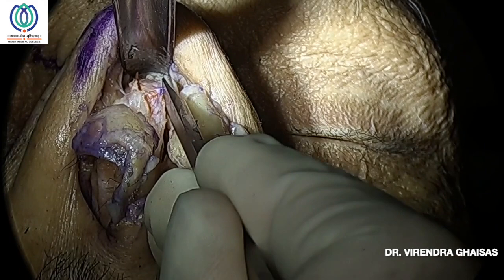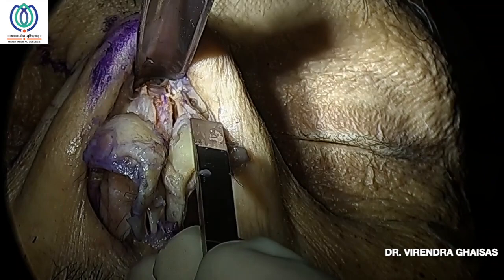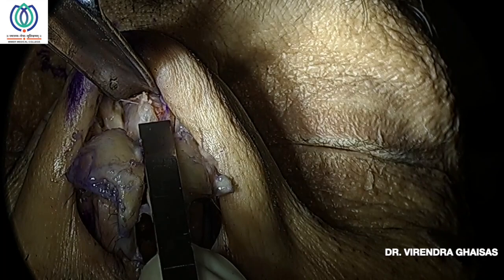Take 2 small stab incisions at the midpoint of the medial canthus and lobule, a little 2 or 3 millimeters above the midline where the nasal length is more, or if you are operating in the mid portion, then you should take it exactly at the midpoint of these two points. Then another stab incision at the midpoint of the medial canthus and the dorsum for the transverse osteotomy.